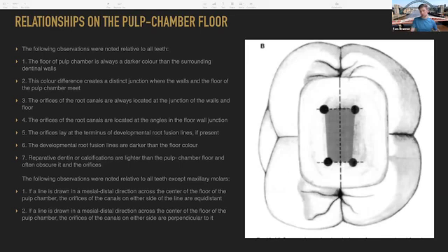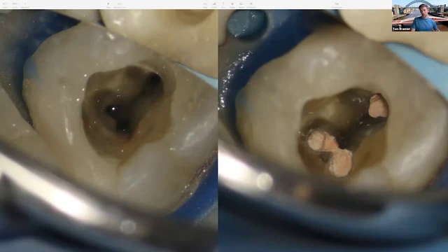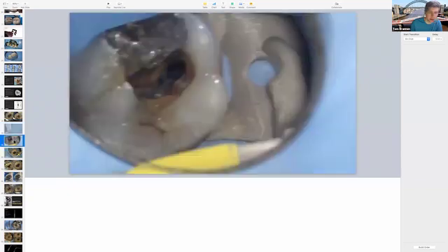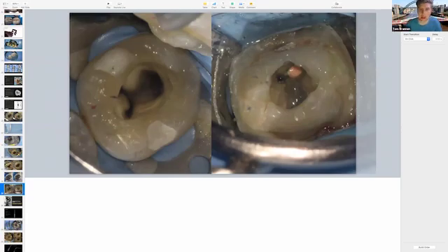Again, if you've got lower molars with 2 roots on the distal, you'll see a little bit more there. That's where you can really see that kind of colour change from the floor to the walls, and even more so when it's dry. Sometimes actually wet in the pulp, you can see things a bit more. You get this angle of reflection through liquid and water. It can show things a little bit more easily. Just videos that'll sort of show things a little bit. But yeah, I'd say that paper is probably the best thing you could look at.